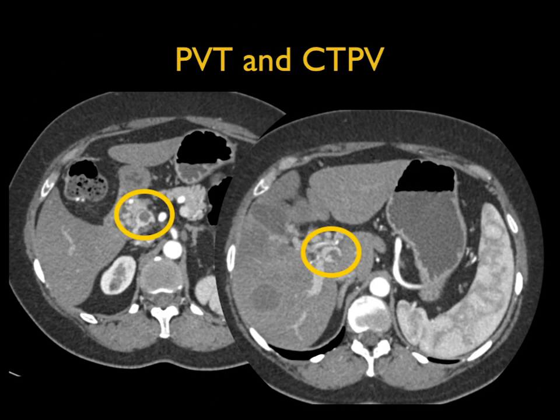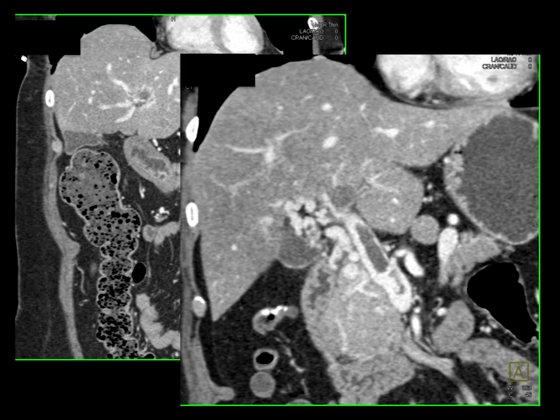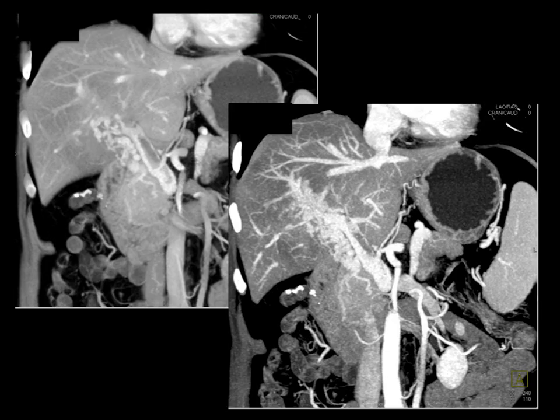Here's another case showing thrombus that is not occlusive in the portal vein, but with multiple collaterals present — the so-called cavernous transformation. On coronal views, you see the collaterals in the porta hepatis. You need to be careful because those collaterals can be called tumor if you don't have good enhancement. This is a very nice example of thrombus in the main portal vein, not occlusive, with cavernous transformation nicely demonstrated.